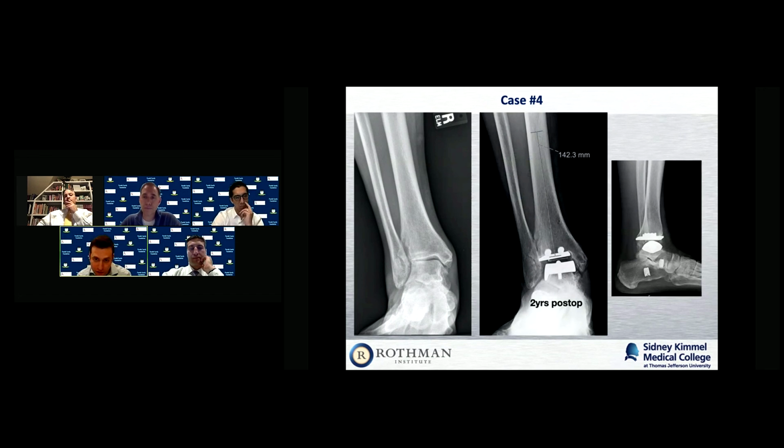Yeah. So I think it's obviously due to the incongruity of the implant and the wear of the talus component into the medial gutter. I think it's going to require either revision with an additional hindfoot realignment. It seems like the initial one wasn't adequate, possibly even addressing something above the implant at the supramalleolar level to try to offset the varus at the knee. Versus your feelings about what implant you like. Would you revise it with this same implant?